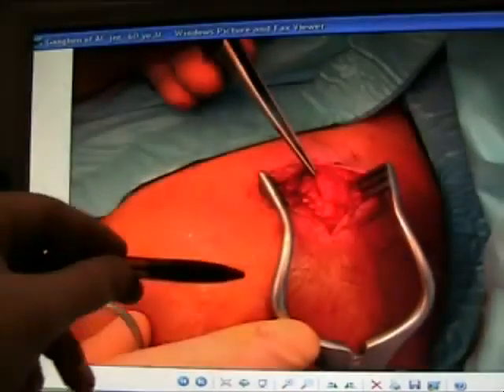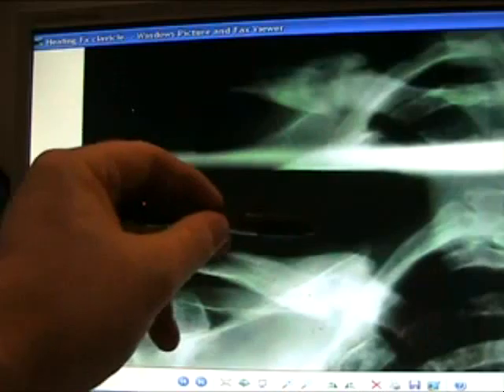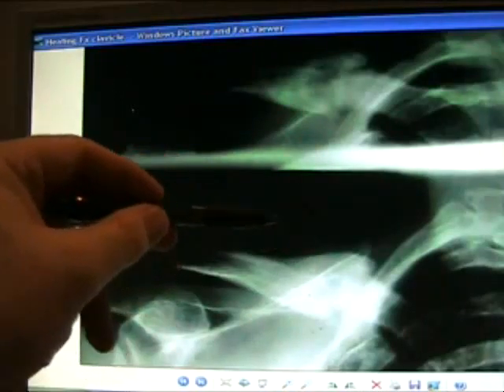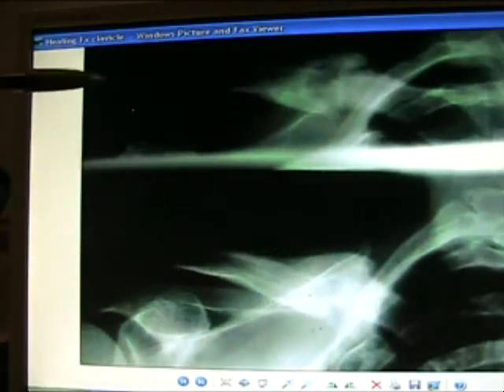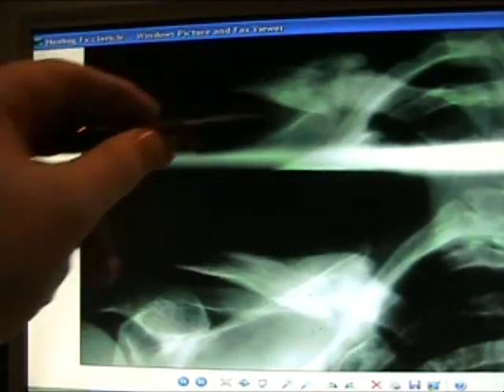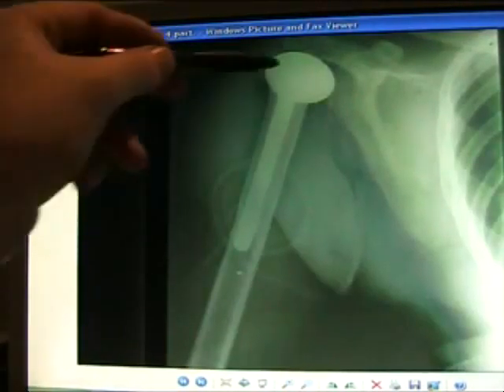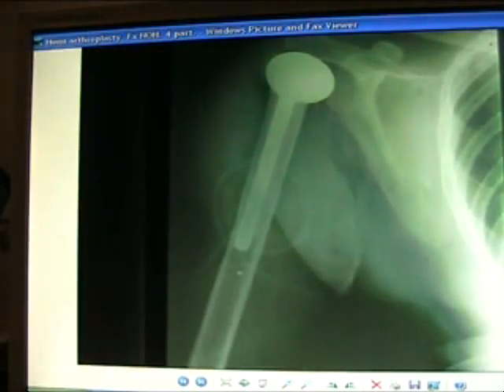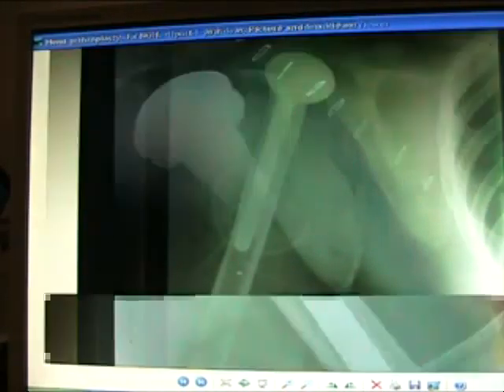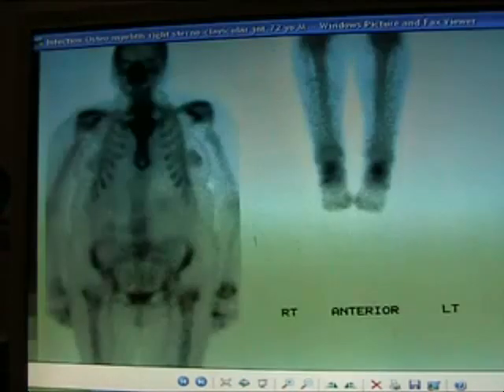Ganglion excised from the AC joint — here it has been excised. A healing fracture of the clavicle with remodeling. Here's a hemiarthroplasty placement for a fracture of the proximal humerus.